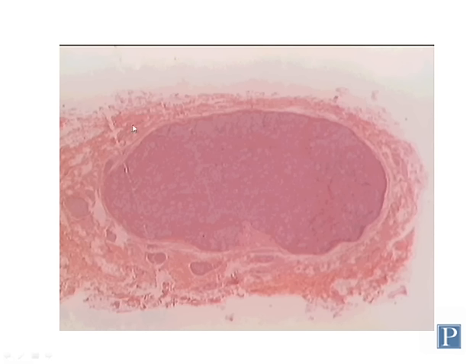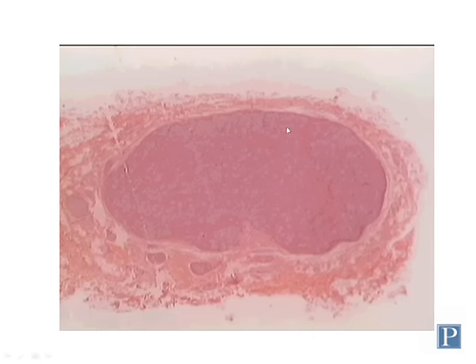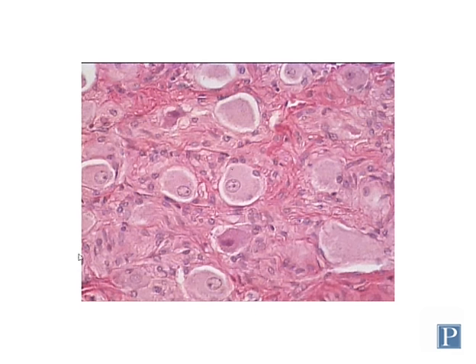So this is not part of the connective tissue capsule. The capsule here is very thin. Again, looking back at the dorsal root ganglion, you can see how much thicker the connective tissue capsule is. So at low magnification, you should be able to distinguish this from a dorsal root ganglion based on the thickness of the capsule. You can also distinguish it with a higher magnification view because the neurons have a different appearance.